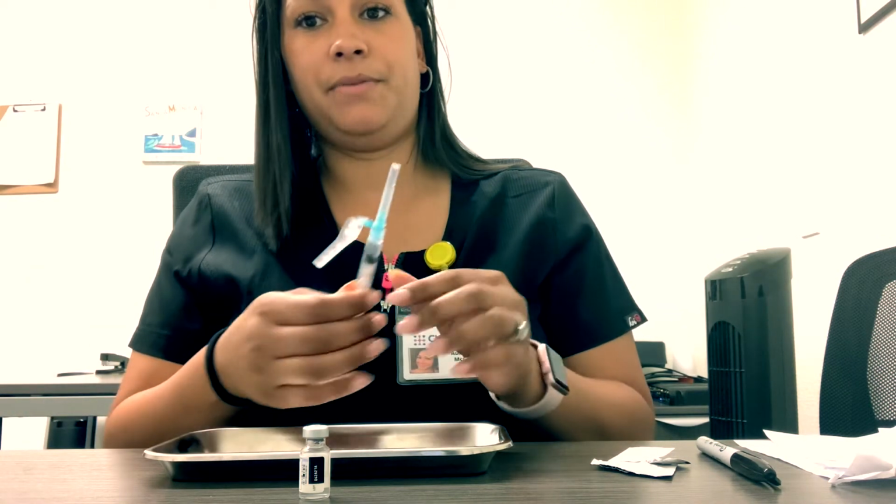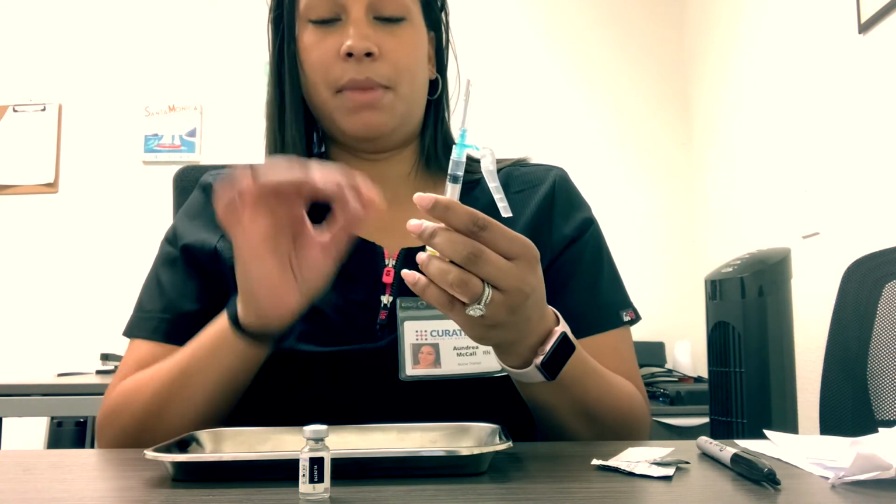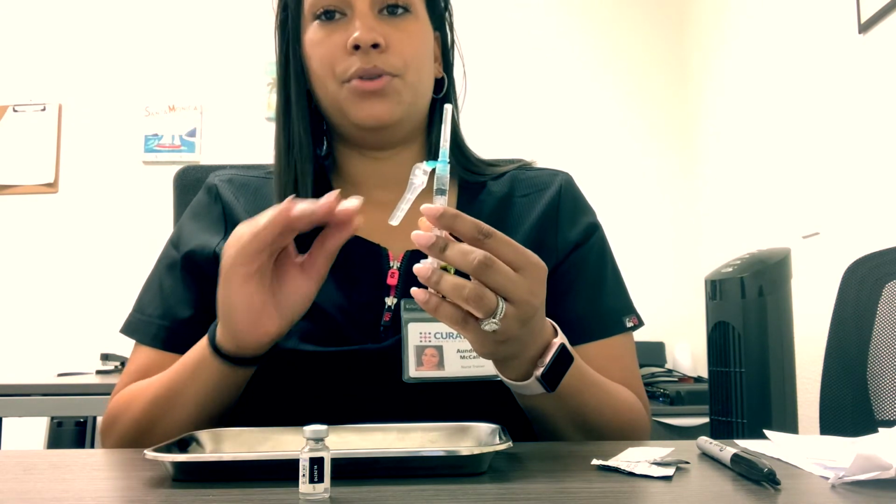After you draw up your vaccine, you are going to verify that you do have the correct dose in there. You want to make sure that it is clear to slightly yellow because this is a viral vector vaccine and that there are no particulates floating in it. At that point, you would go ahead and pass it off to your administering nurse.